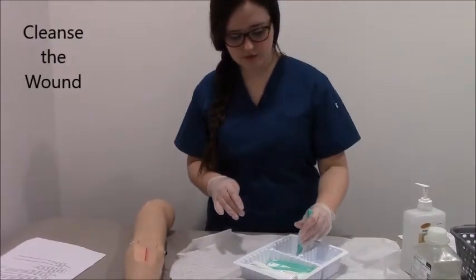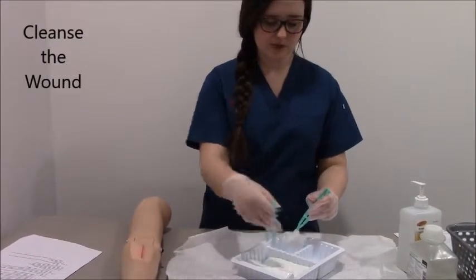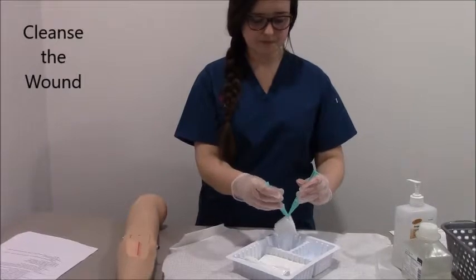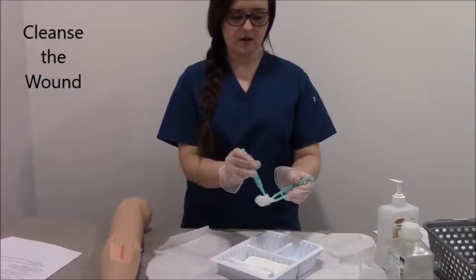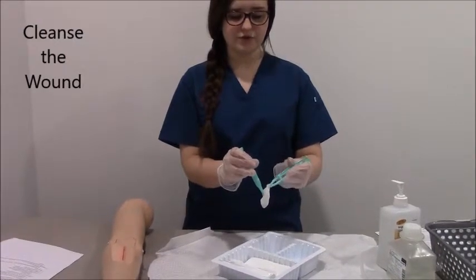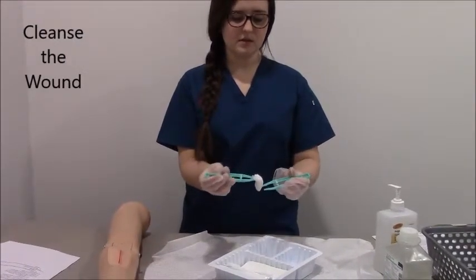So I'm going to use my tweezers into a little bowl.